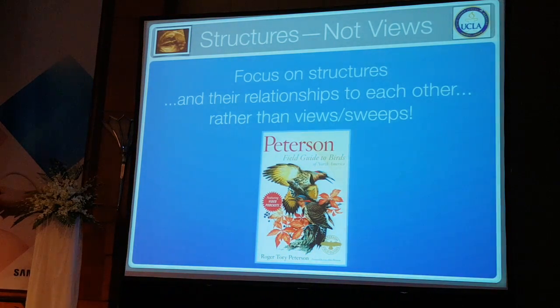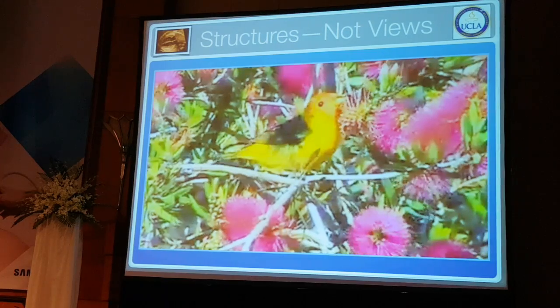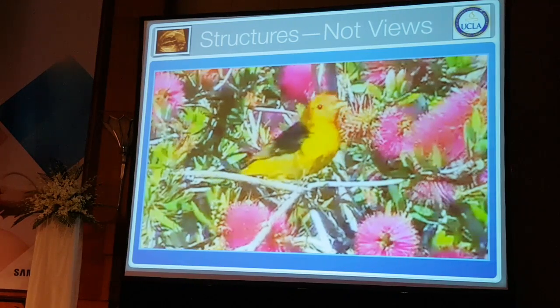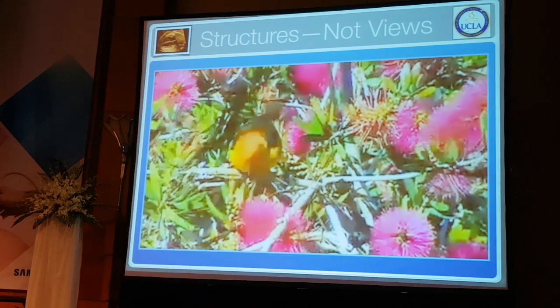So I mentioned before the importance of focusing on structures. When you're evaluating the heart, there's lots of different views to keep in mind, all these different views that are in the guidelines, but really the important thing is not the views themselves, but we use them to see the structures. And this is an example I use. This is a bird. I don't know if any of you like to look at birds. I like to look at birds and to identify the bird.